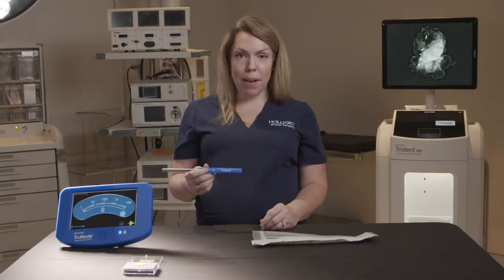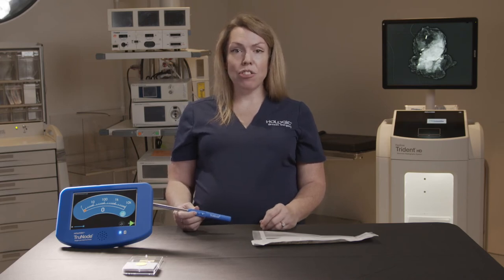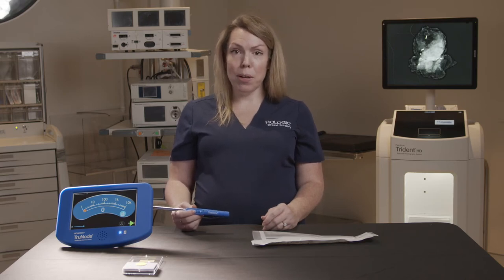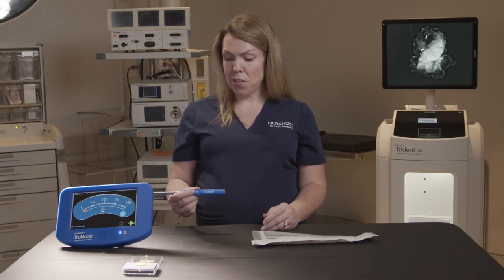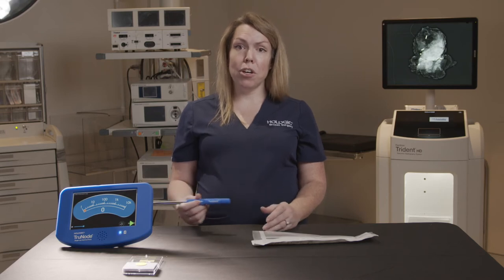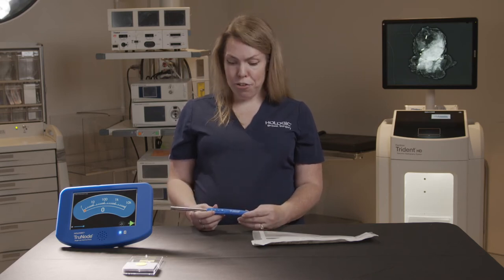By holding in the plus button we're actually able to go into a high range, which actually adjusts the audio feedback down to make it easier for the surgeon to hear the audio once we are approaching those higher counts. To go back into low range we would just hold the minus button and then we would return our audio feedback to normal low range.